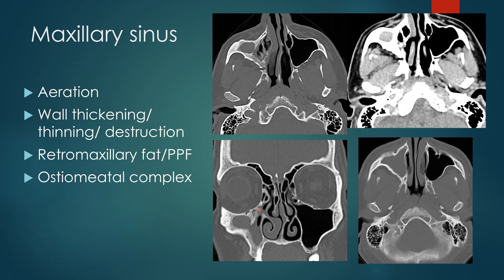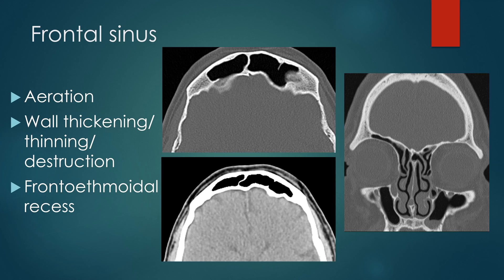In the frontal sinus, you also discuss how aerated it is — this is a well aerated frontal sinus. You look for areas of bony wall thickening, thinning, or destruction, as we discussed in the maxillary sinus. The drainage of the frontal sinus is through the frontoethmoidal recesses — a tract from the frontal sinus to the anterior ethmoid air cells — and you'd like to see a patent frontoethmoidal recess on both sides.